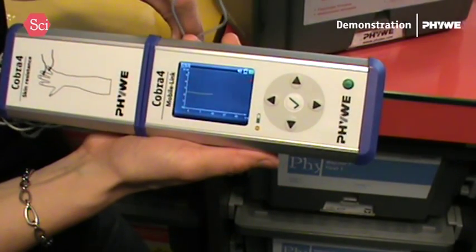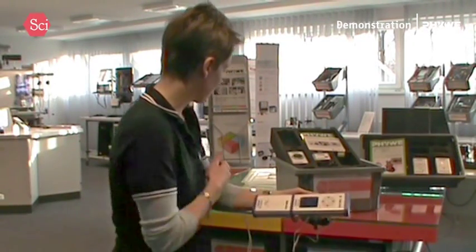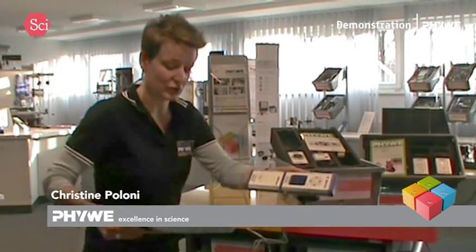So actually, at the moment I'm stable at about 2.5 or 2%. And if I now make a test which is going to ask me to concentrate very highly, we will see my results going way up.